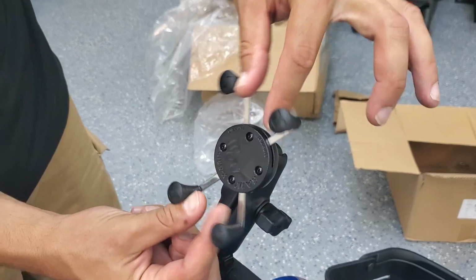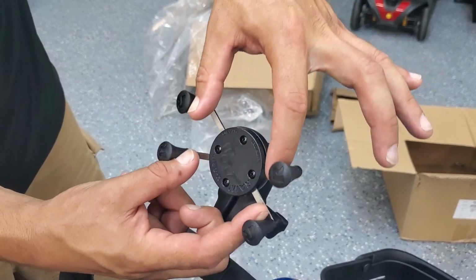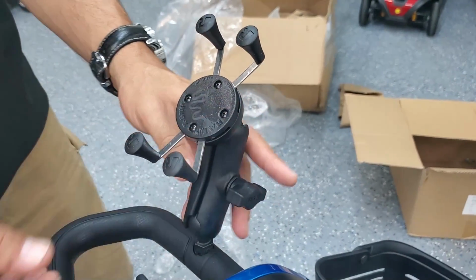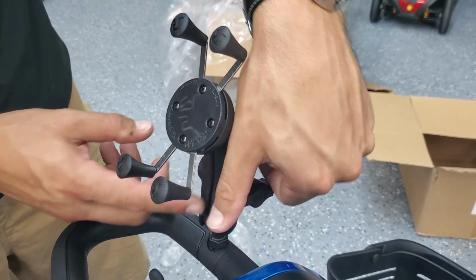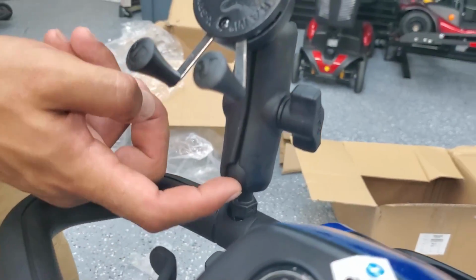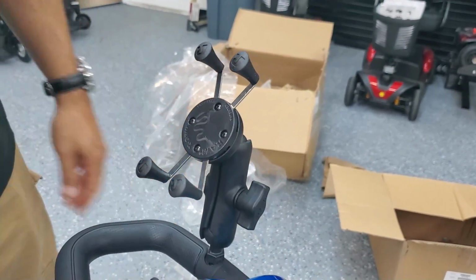The phone, you just squeeze it in there and it gets the tension of these prongs that have springs on them, which hold it into place. So once you have it positioned the way you want it, whether it's like that, like this, like that, you tighten this knob back up, and that's going to compress these two side pieces so that the ball that's allowing it to rotate gets stuck, and it fixes it into place for you.